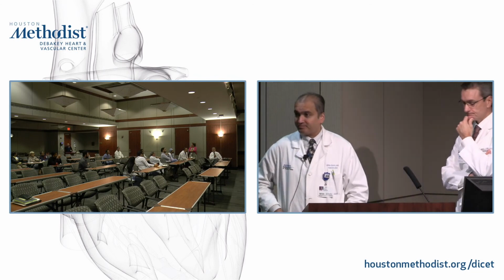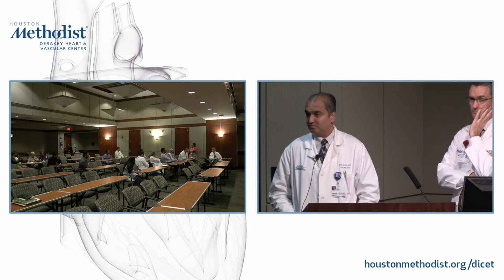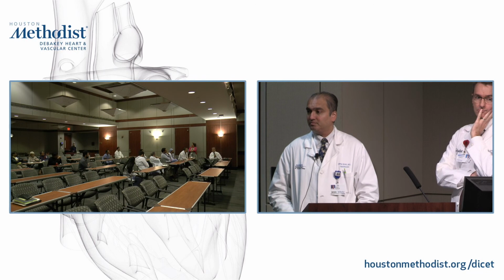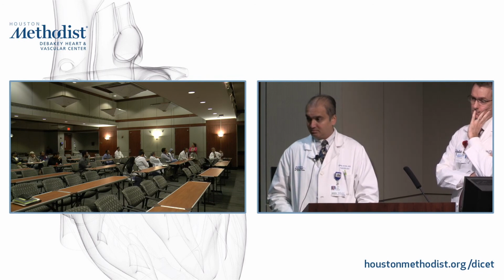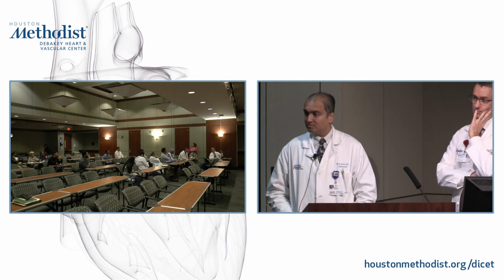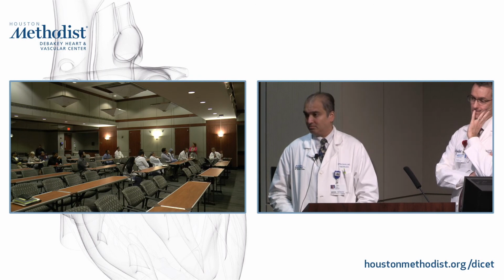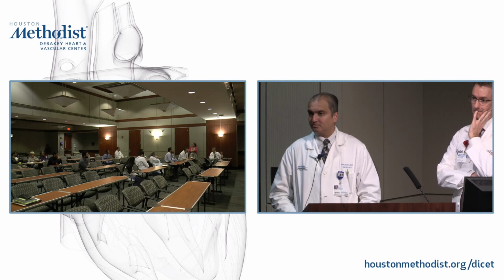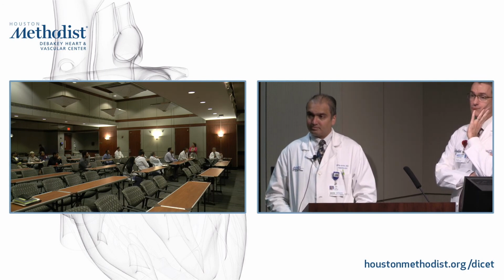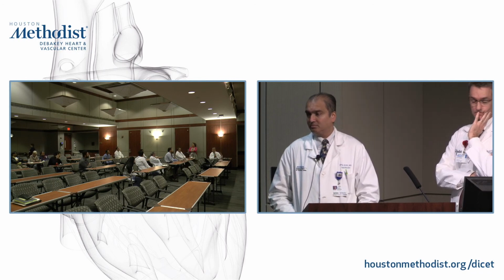And the other suggestion, we didn't delve into it, meaning we didn't stick our neck out in the guideline recommendation. But if you ask me, where does TEE versus CMR fit in your armamentarium? When would you go for one versus another? I think TEE has great spatial and time resolution. So if the issue is, I have a decent transthoracic, but I don't understand the mechanism of the regurgitation, I would go for transesophageal. If the issue is quantitation, if you have a very eccentric jet and you have issues quantitating, transesophageal is not going to help you quantitate it.